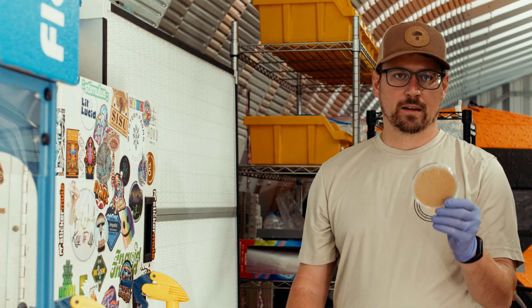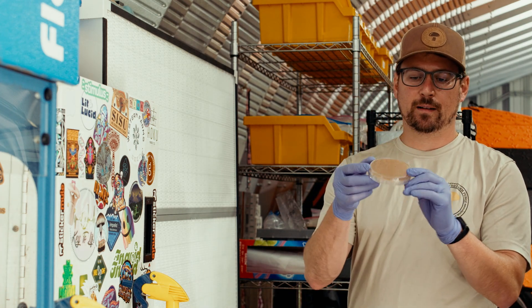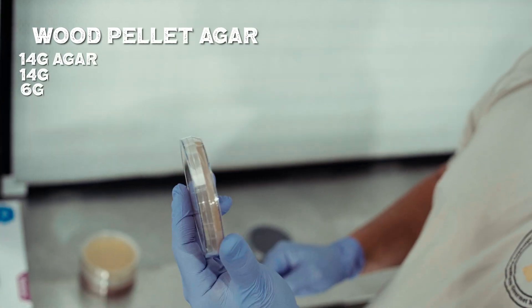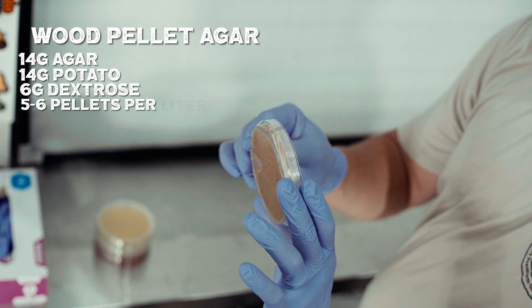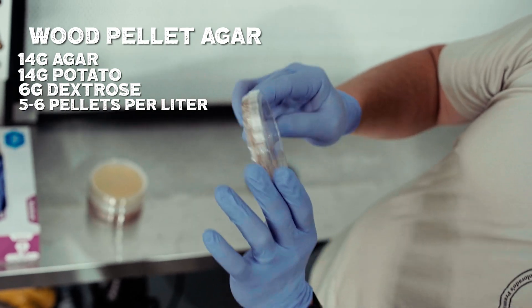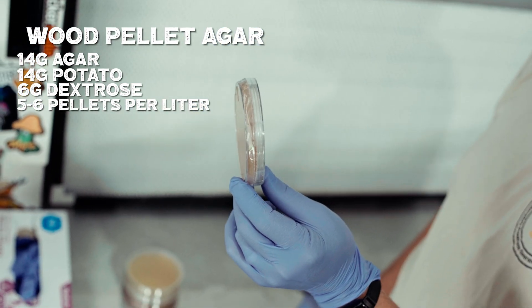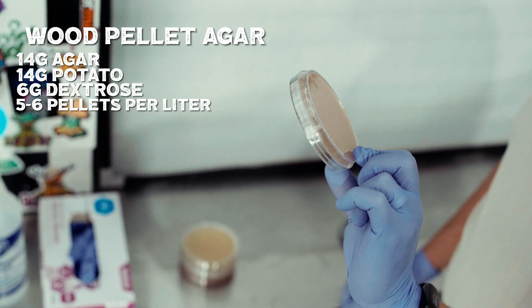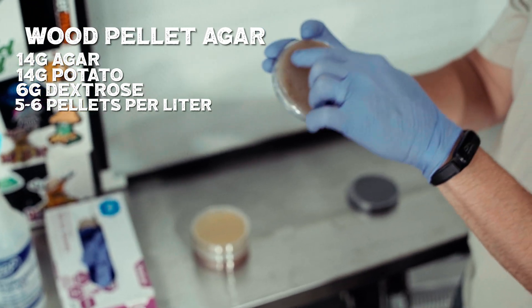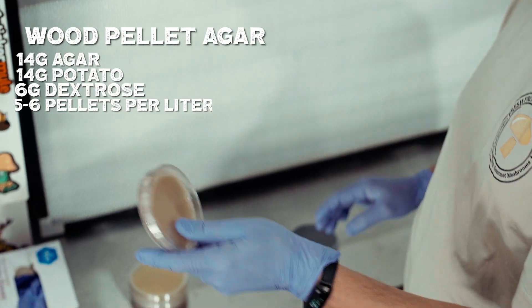Fourth, we have our wood pellet agar. It's 14 grams of agar, 14 grams of potato, 6 grams of dextrose, and about 5 or 6 hardwood pellets per liter. I mix that all together and you can see the even distribution of the wood inside the agar.